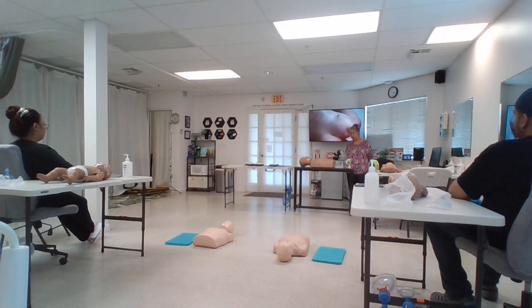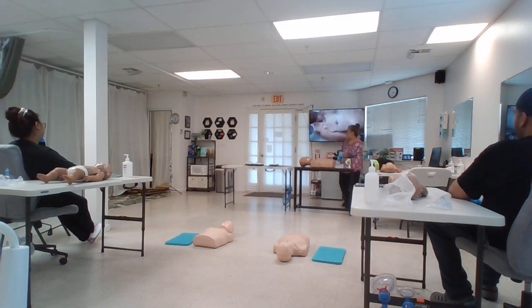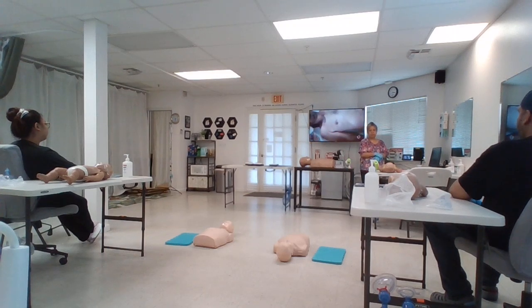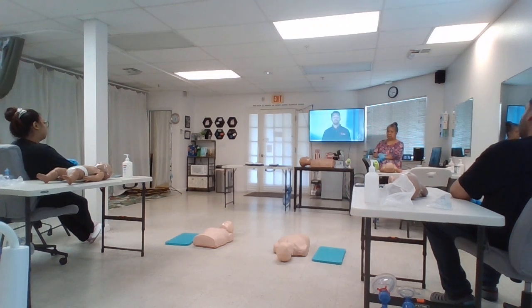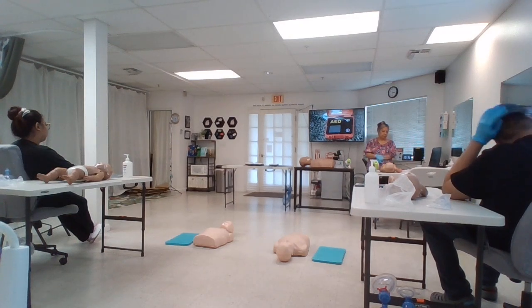Some people have an implanted pacemaker or defibrillator in the same place where you would put the AED pads. These devices look like a round or square lump that's smaller than a deck of cards. If you see this lump, avoid putting a pad directly over it. Also, don't place a pad directly over a medicine patch. If a medicine patch is located where you need to place a pad, take the patch off and quickly wipe the chest before applying the pad. If the victim is wearing an undergarment containing metal, be sure to apply the AED pads on bare skin, avoiding contact with the garment. You should familiarize yourself with the AED model in your workplace.